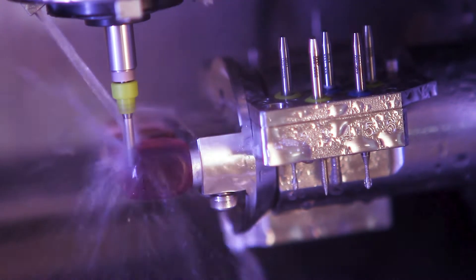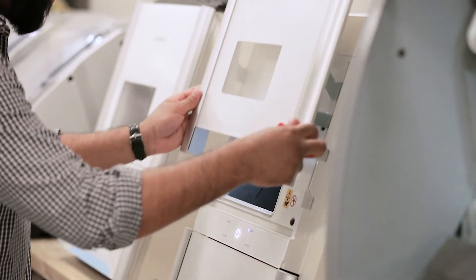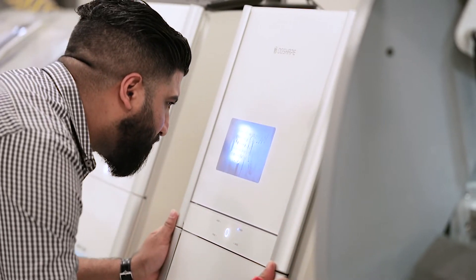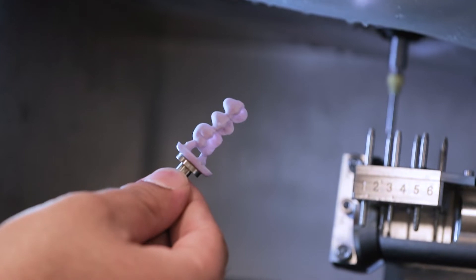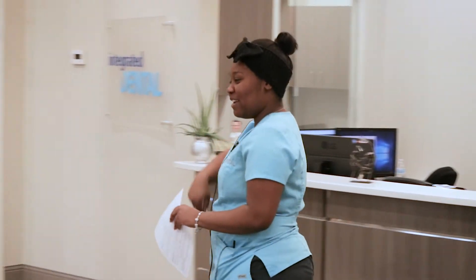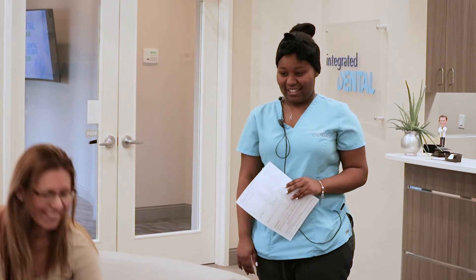On a typical day, we're using our DG Shape milling machines to make our patient visits faster and more effective. The consistency and predictability of having a fantastic restoration made for us has made it more profitable, and it's also allowed us to offer services that we could never offer in the past.